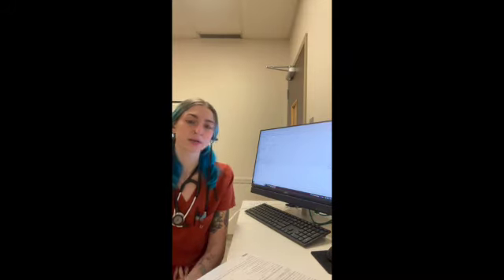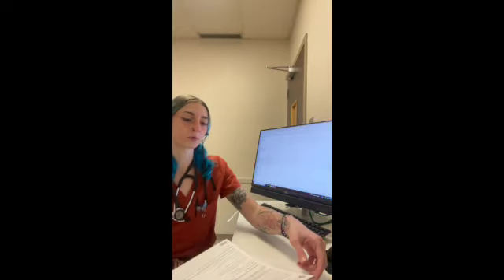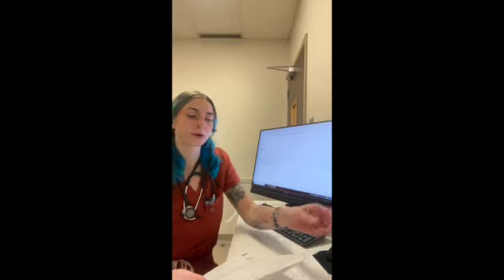So I'm going to go ahead and start with your admission record. The patient that I will be admitting today is a 7-year-old female spayed golden retriever whose name is Stinky Grandma, and she is presenting today for a mast cell tumor removal. So I have our admissions record here.